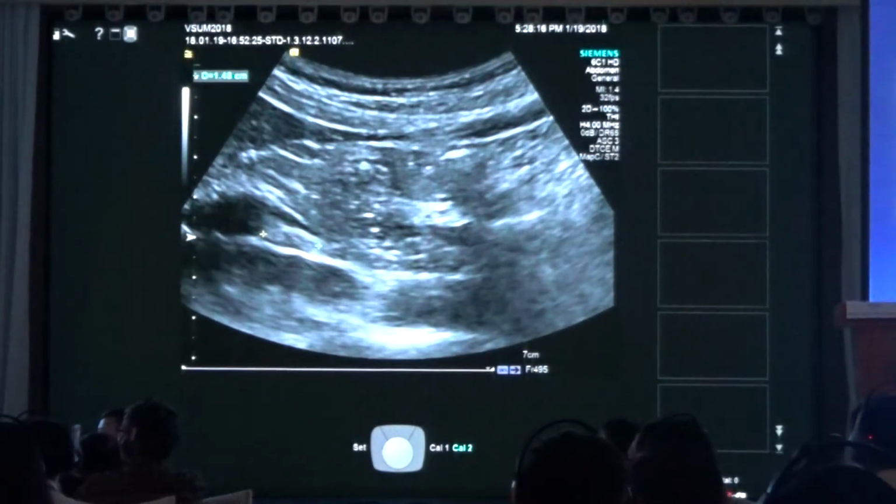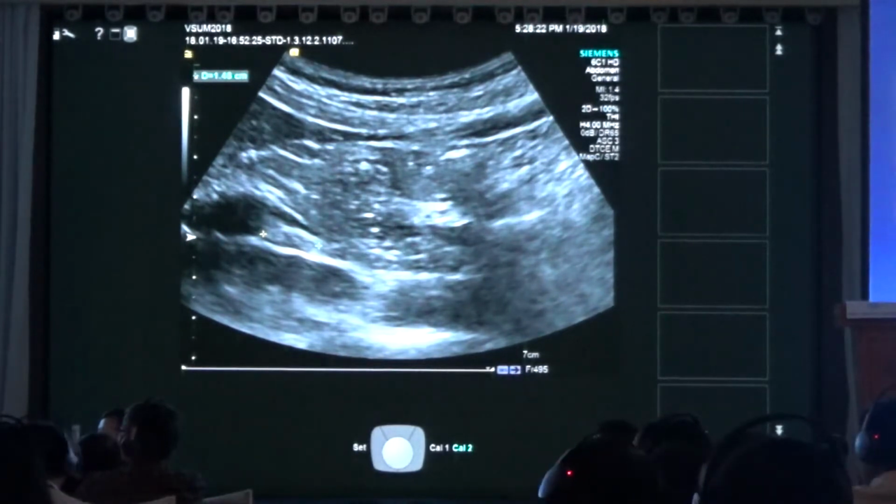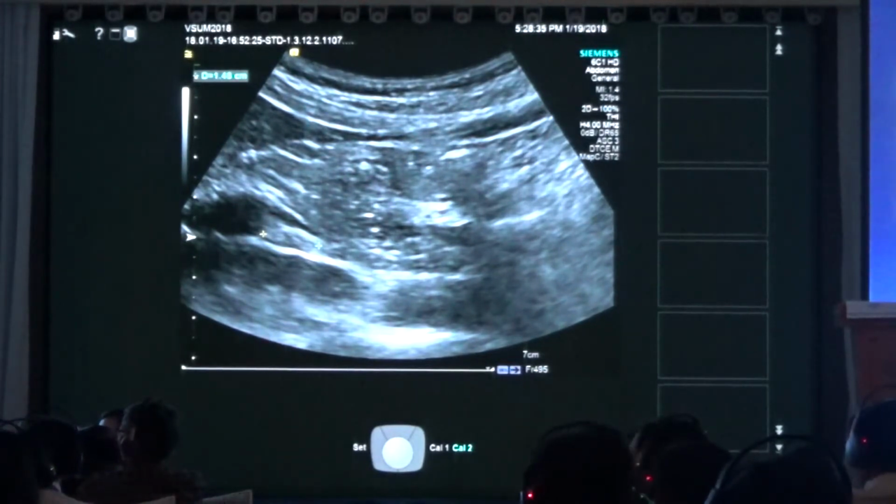As you mentioned, for shear wave in other organs, you need to have no respiratory movements. So it depends on the machine. It might be a slight movement for transient elastography and point shear wave elastography. The more 2D, the larger the volume, the more time you need. No respiration.